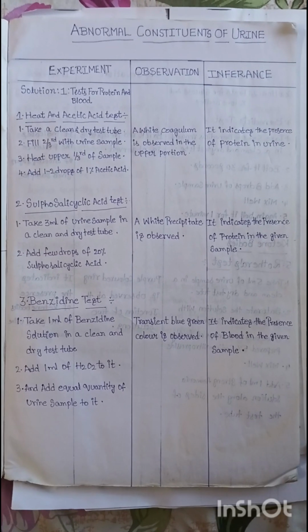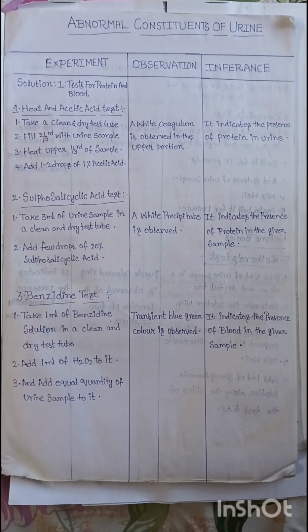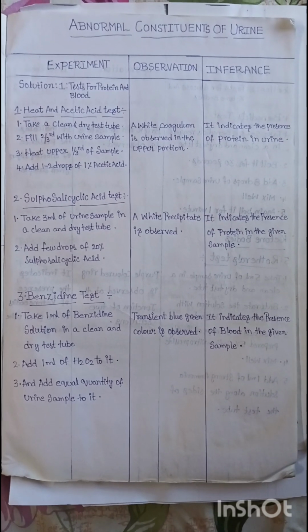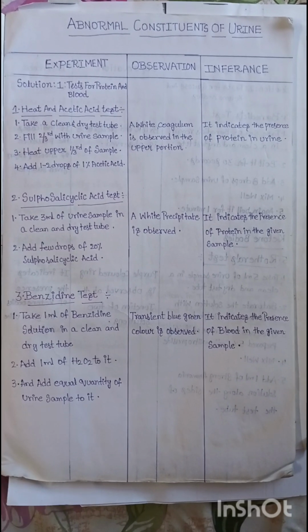Hi students, good morning. Today I am going to teach you about the abnormal constituents of urine. This is one of the major practical tests that we used to conduct in the laboratory for first year MBBS students who are studying biochemistry.